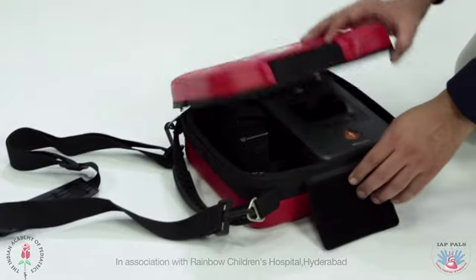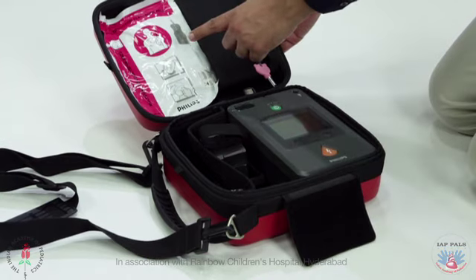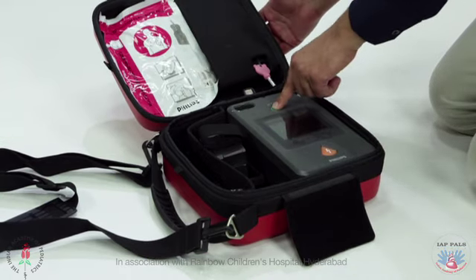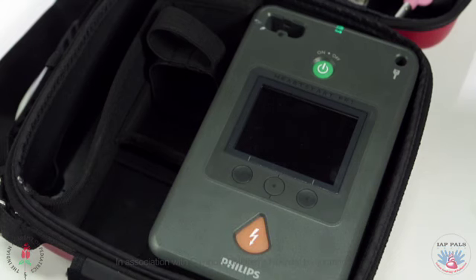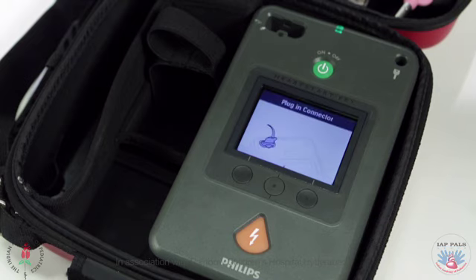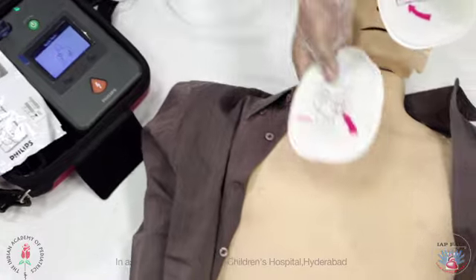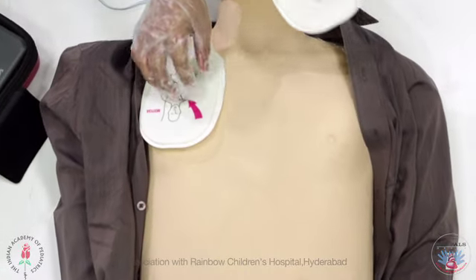Turn on the AED. To do this, you have to open the carrying case. Then you need to carefully listen and follow the AED instructions. The AED will instruct you to apply the pads on the patient's bare chest at the specified position. Some AEDs may have adult and pediatric pads. Adult pads should be used for those who are 8 years or older. Now, on the victim's bare chest, attach the adhesive pads.